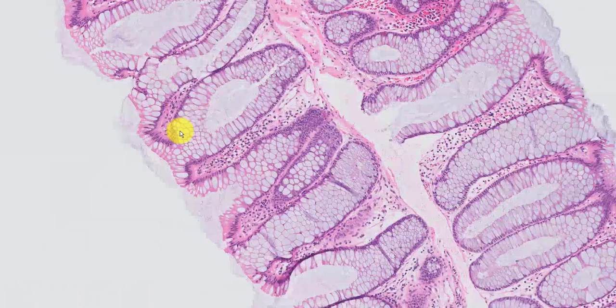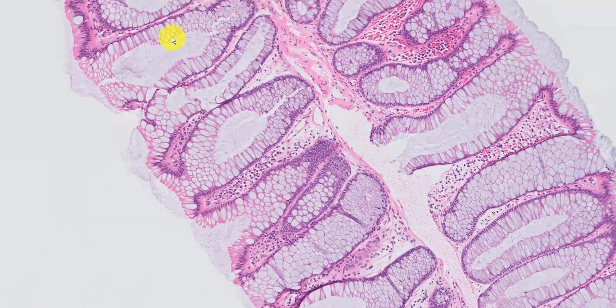But you see that expansion or lengthening of the colonic crypts, some dilatation of the colonic crypts, an attempt perhaps at serration, but it is subtle. And the entire epithelium, instead of being lined by that microvesicular epithelium, is now lined by goblet cells.